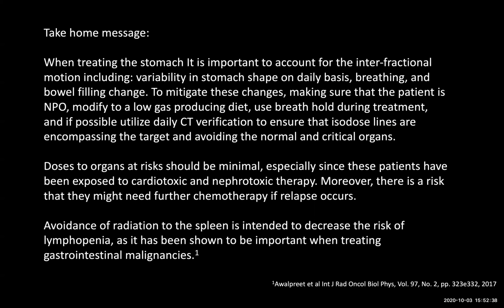So the take-home message, when treating the stomach, it is important to account for the interfractional motion, including variability in stomach shape on daily basis, breathing, bowel filling change, and to mitigate these changes, making sure that the patient is NPO, modified to a low gas producing diet, use breath hold during treatment, and if possible, utilize daily CT verification to ensure that isodose lines are encompassing the target and avoiding the normal and critical organs.